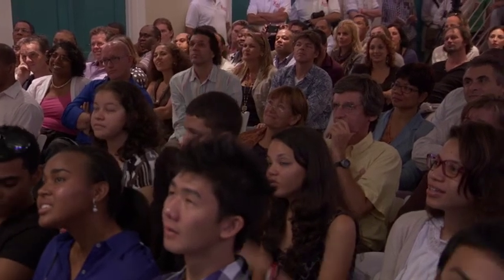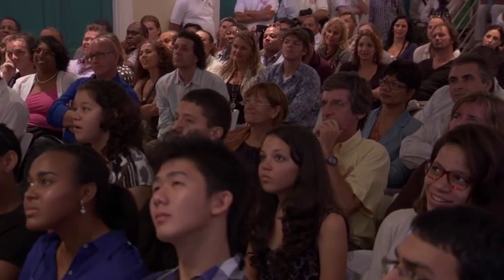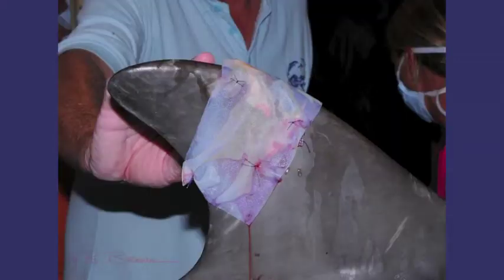Here you see the process at the makeshift operating theater where the matrix material was sutured in, and you can also notice that the animal out of the water has to be cooled with bags of ice. This was the last piece of matrix material for the outside area. Here you can see a close-up of it, sutured in.